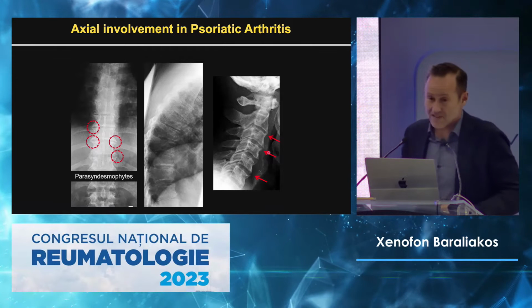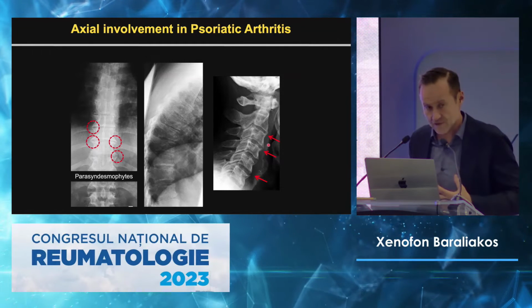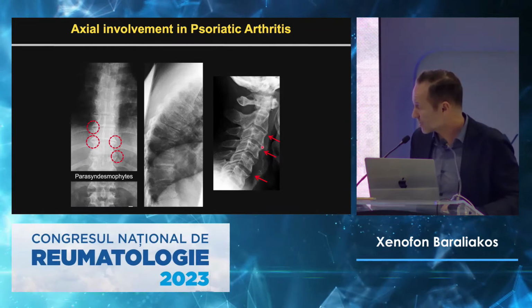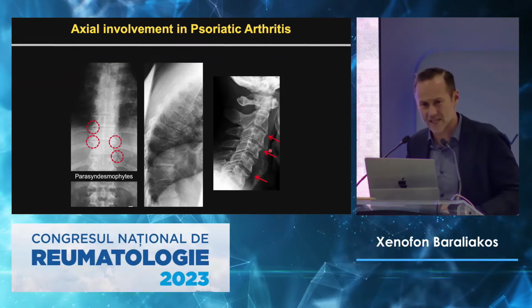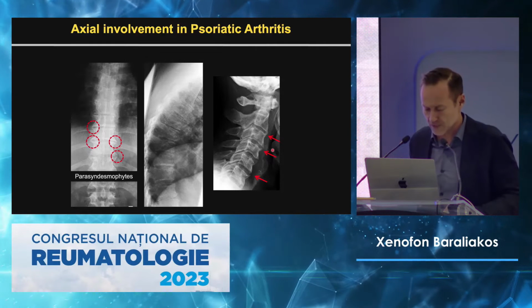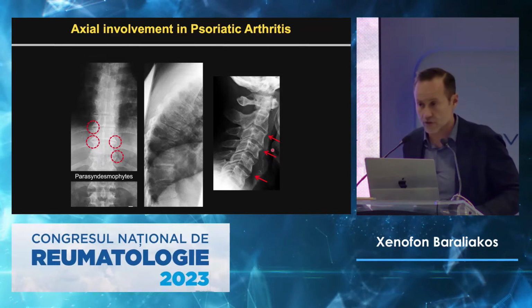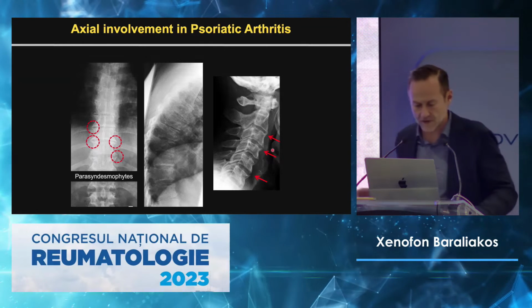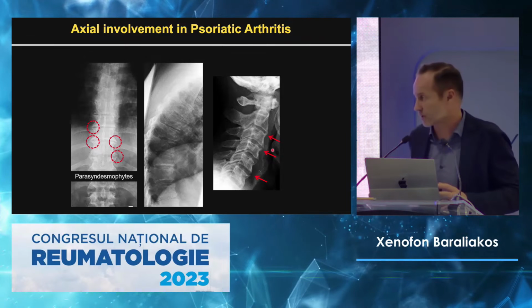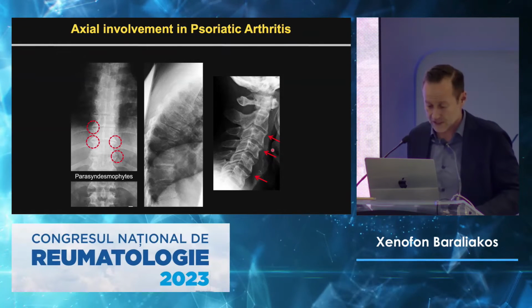And in PsA, we have something in between. I'm just bringing this up because if we have axial involvement of psoriatic arthritis, they're also bridging, but they look like this. If that patient has psoriasis, then I would rather call it involvement of the spine in PsA. But sometimes these patients also have metabolic syndrome. They're overweight, they have hypertension, they have diabetes, and then you may have this and psoriatic arthritis. Yeah, it's always a mixture. It doesn't have to be black and white.